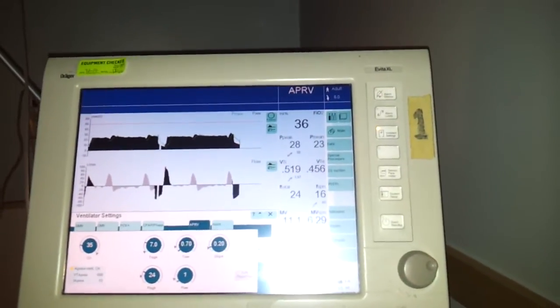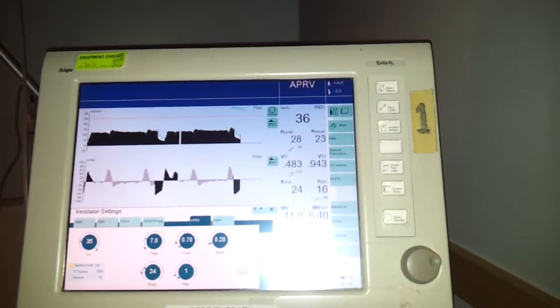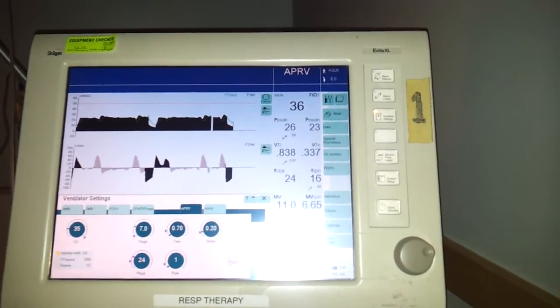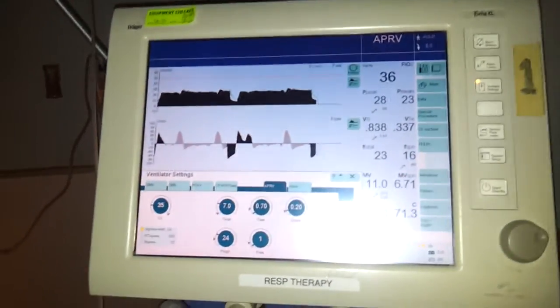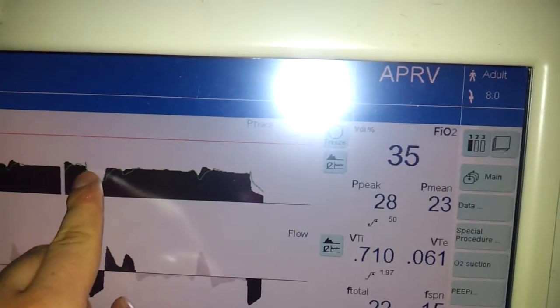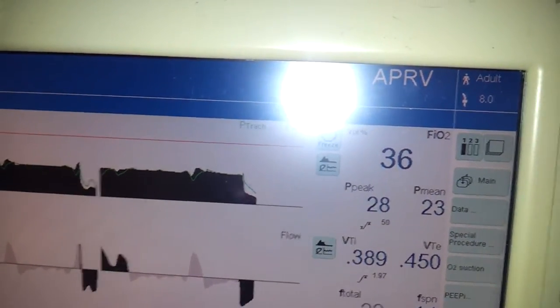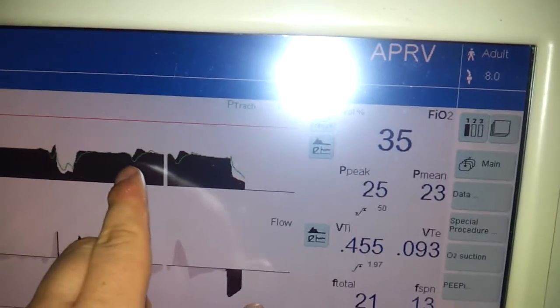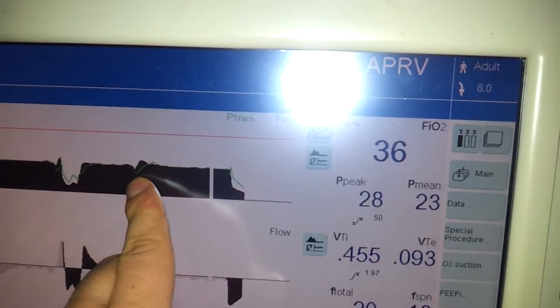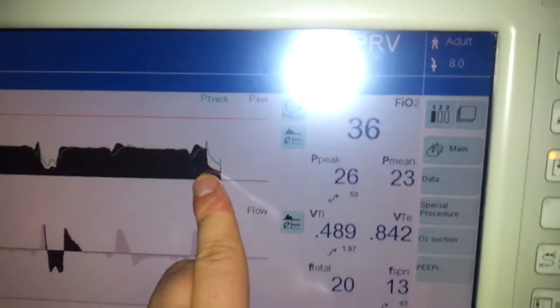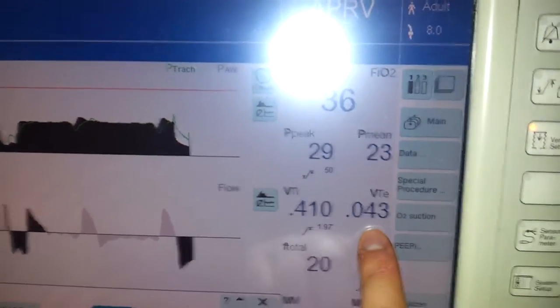APRV provides two levels of continuous positive airway pressure and allows for spontaneous breathing at any point. If you look at the pressure waveform, you can see the two different levels: P high and P low. You can see patients can take spontaneous breaths anywhere in between — little breath, little breath — and then P low.